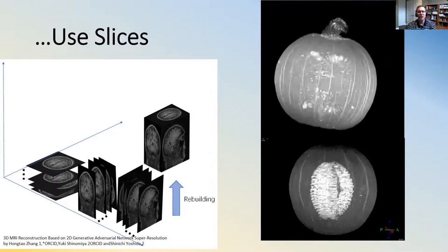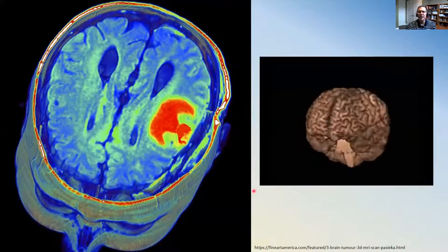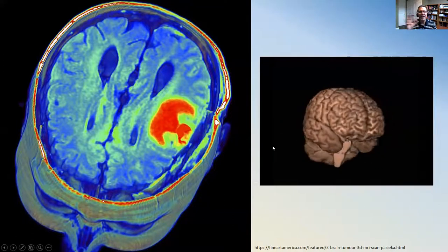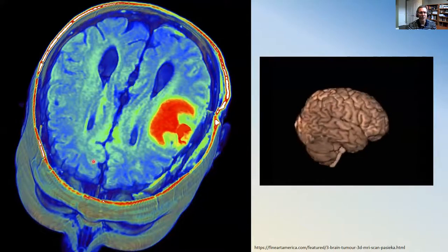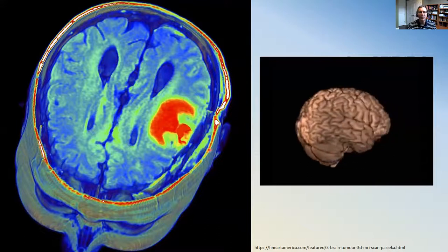They're going to look at individual slices and scroll through them. Same kind of idea here. Here's a three-dimensional MR image of a brain spinning in space. Beautiful 3D picture. It's cool, but because it's 3D, you can't actually look inside at what you want. So a doctor would rather say, I don't need the full 3D data. I'm going to go through that brain from top to bottom, and then they're going to stop at a certain slice, and oh, here's a bleed or a lesion that that person is looking at.